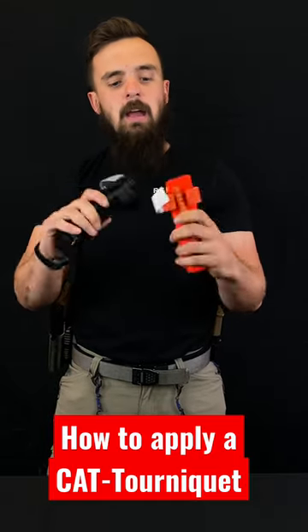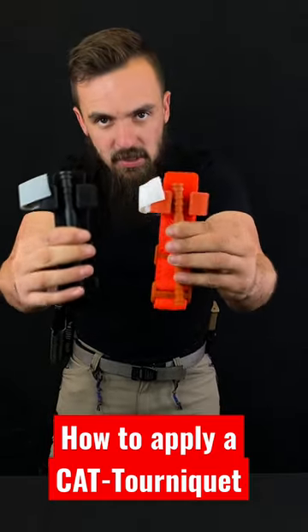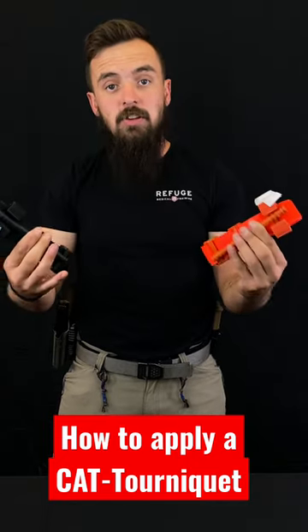Hey guys, Bob with Refuge here and today we're talking about Cat Gen 7 tourniquets and I'm going to show you really quickly how to apply one.